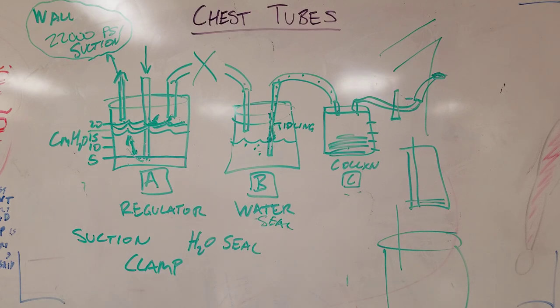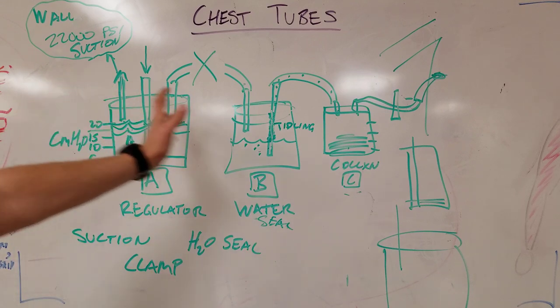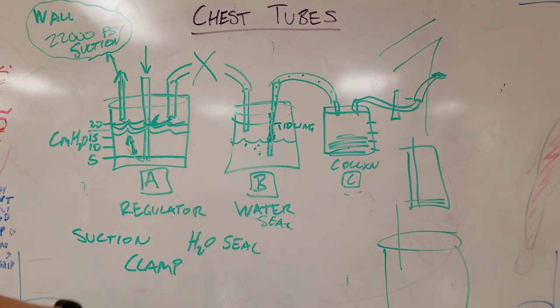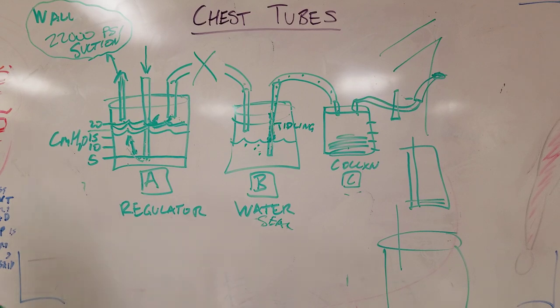And so when you're reporting on a chest tube, you're telling someone what the current status is. What you want to know is, hey, is that chest tube to suction? Meaning, is it hooked up to wall suction, everything's open? Is it water seal? It's not hooked up to any suction tubing, he's just carrying his pleurovac. Or is it clamped? And that means he, no joke, has a clamp on the tube. Those are the three different options that you have. The next thing you want to report is, is there an air leak?